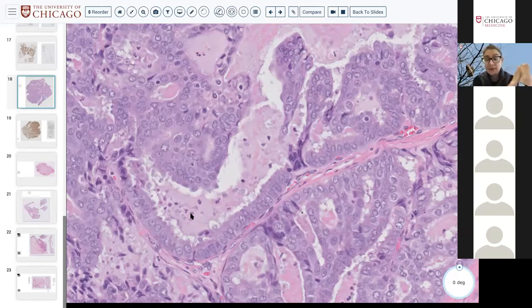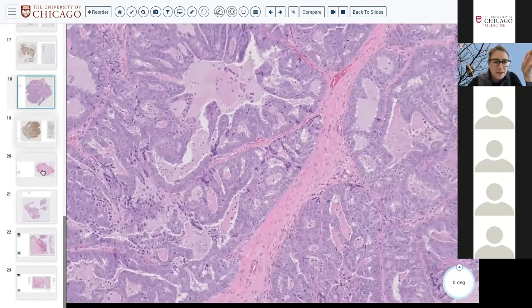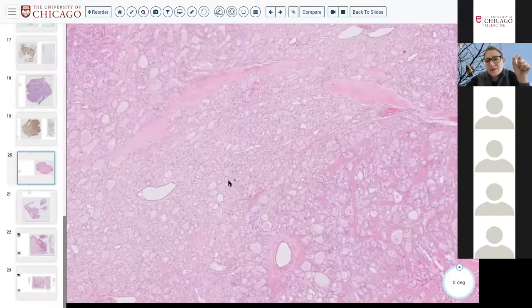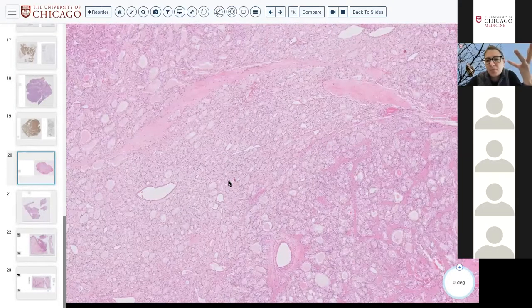Now we're getting into the weeds. When you have a salivary type secretory carcinoma, the secretory material in the lumina stains, but there's no intracytoplasmic mucin or intracytoplasmic zymogen granules; there's just secretory PAS positive material in the lumen of the glands. So arguably you don't care about the extracellular material as much as the intracellular material, because you want to be able to differentiate the actual cell. You care less about the material that's outside.